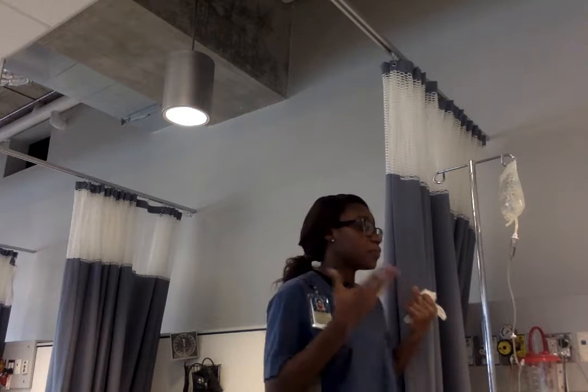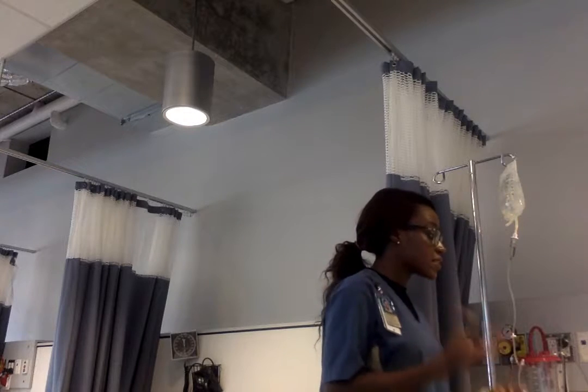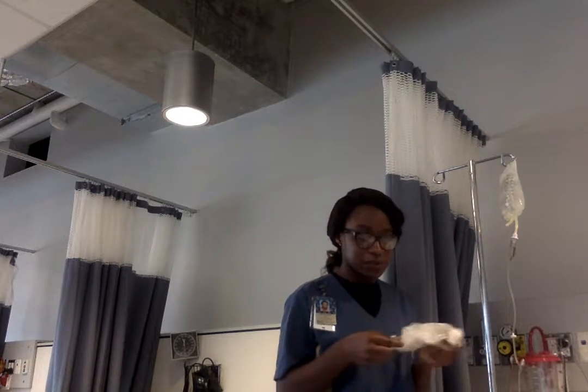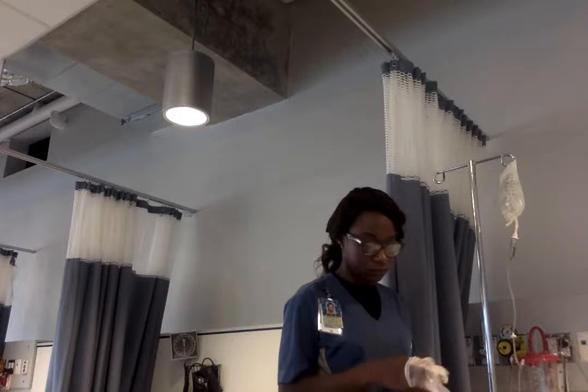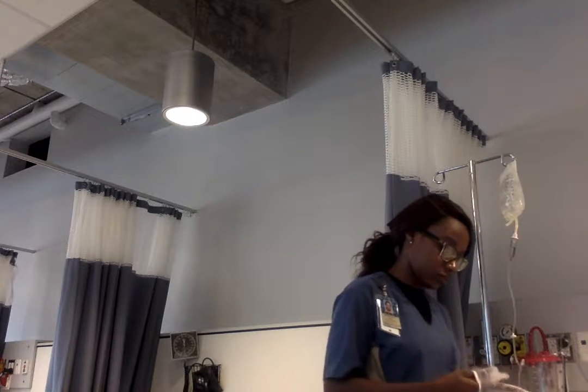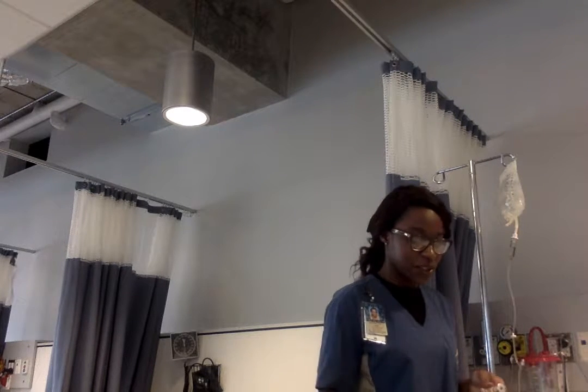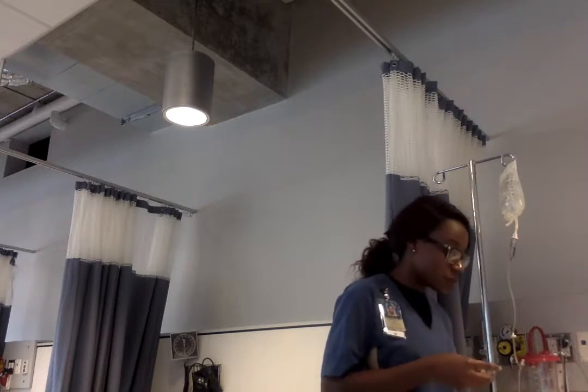So now Mr. Tutu, today I'm going to be giving you some Gravol through your IV because I understand you've had an upset stomach. Is that okay? So I've explained, and I've asked his permission to give him his medication. So right now I'm just going to put on my gloves, and assess the IV site for any irritation or redness. There's none. He is good. So now I'm just going to compare my medication against his armband, making sure that I have the correct client again. Mr. Tutu.